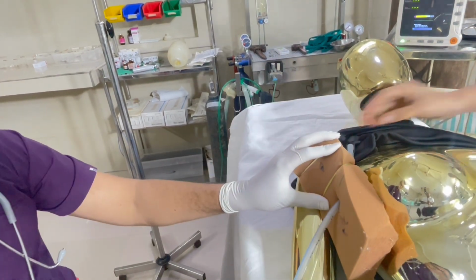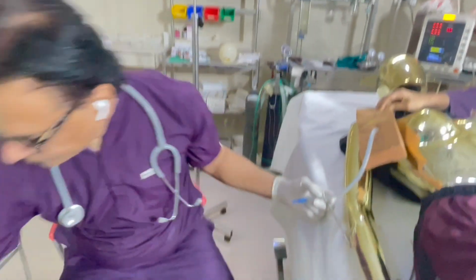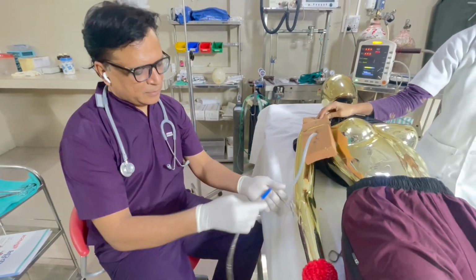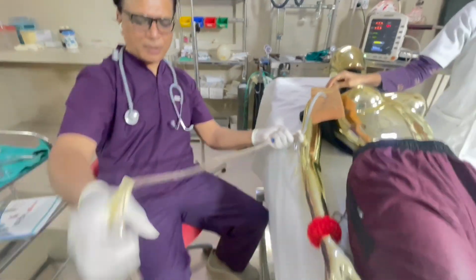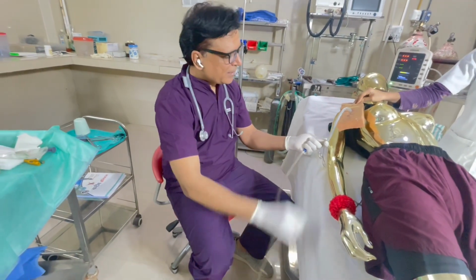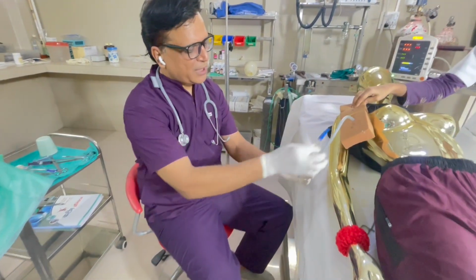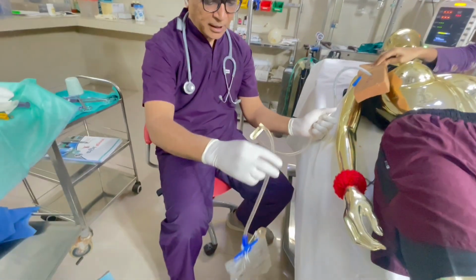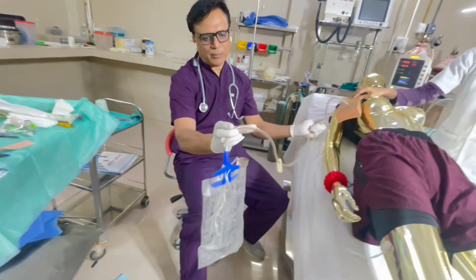then you have to connect this drain to the underwater bag. This underwater bag is like this, so that the lower end has the water filled, and you connect it and release the clamp. Once you release this clamp, you have to check and see if the person is coughing or air bubbles are coming, and when the person is breathing, you will see the water column moving in this.